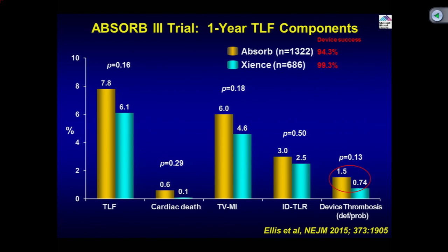The key difference in the delivery system is the hypotube, which you're actually holding and pushing, is more supportive, a little more rigid, and the actual plastic part of the catheter from the RX notch all the way to the balloon is a little beefier too. So you can definitely feel the push better, but the flexibility of the balloon, the scaffold, and the tip are still the same.